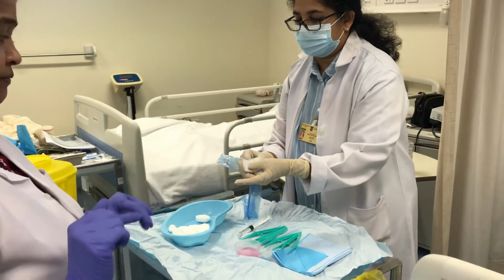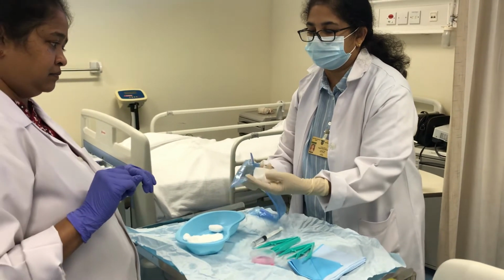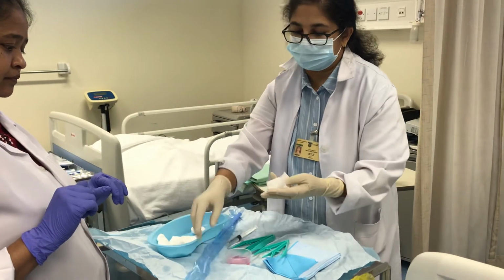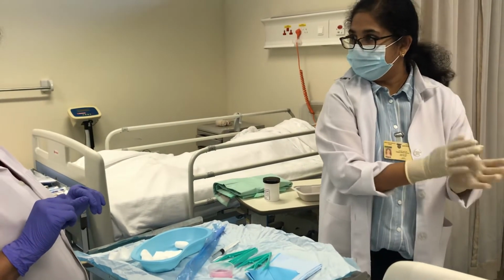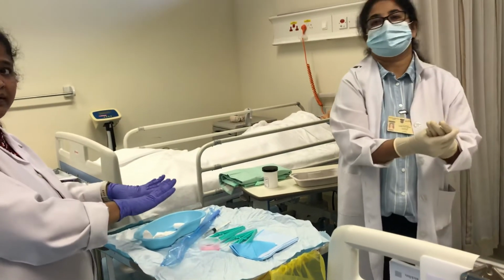That's easier. But one thing I forgot, as told, I didn't assess the patient's perineal area. I think that we need to assess the perineal area. That should be the first, the perineal care.